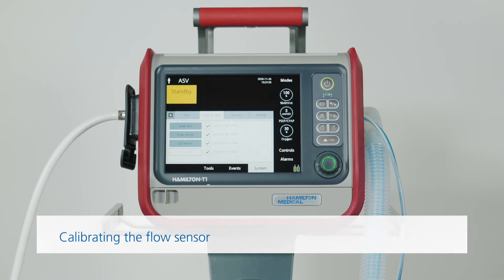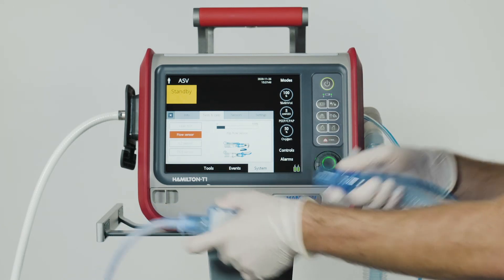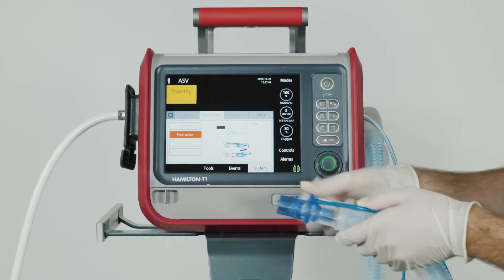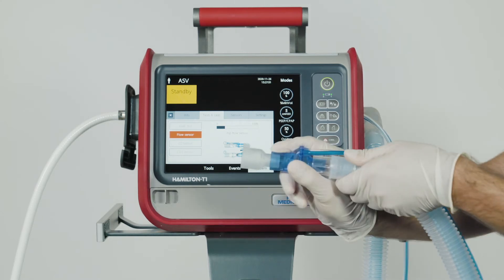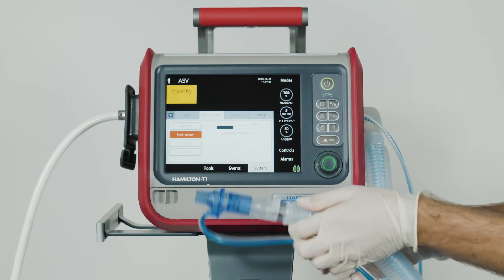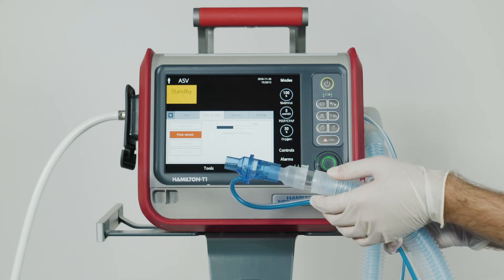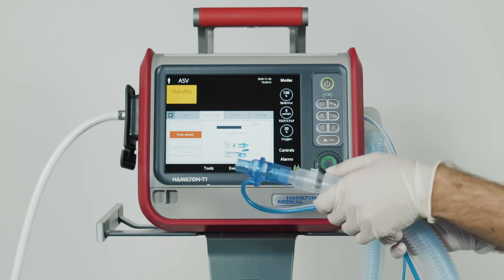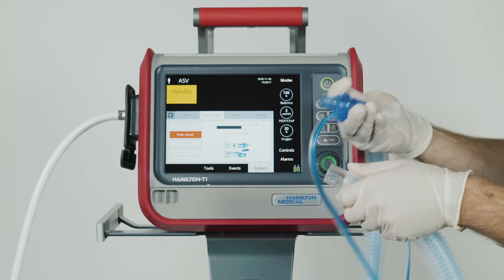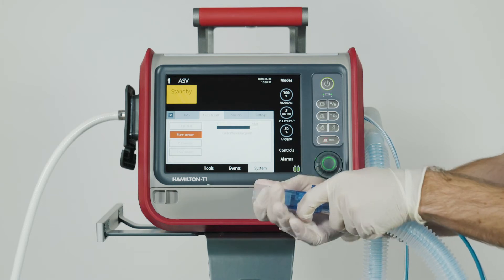To calibrate the flow sensor, choose this function and then follow the instructions on the ventilator. When the message saying 'Disconnect patient' appears, you should disconnect the test lung. Then attach the adapter to the flow sensor. When you see the message 'Flip flow sensor', flip the flow sensor around. Then wait, and flip the flow sensor back to its starting position again. Once you've done that, you can disconnect the adapter from the flow sensor.